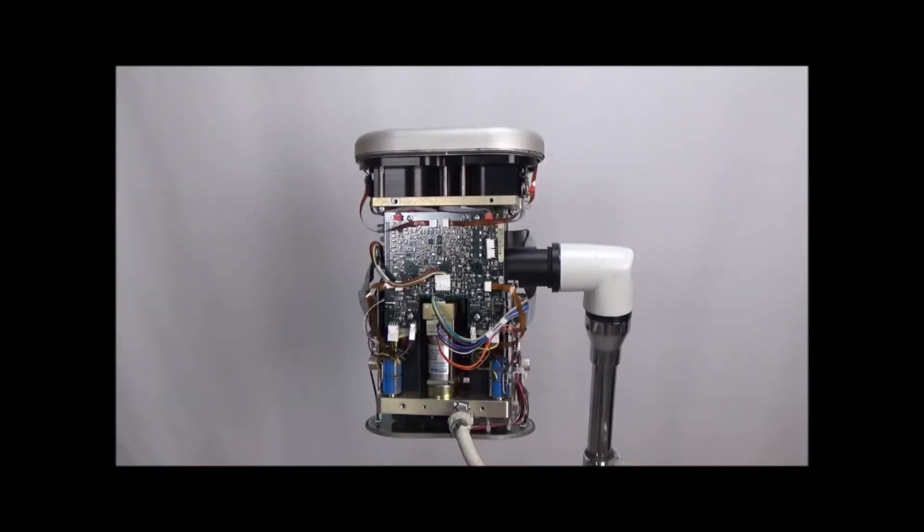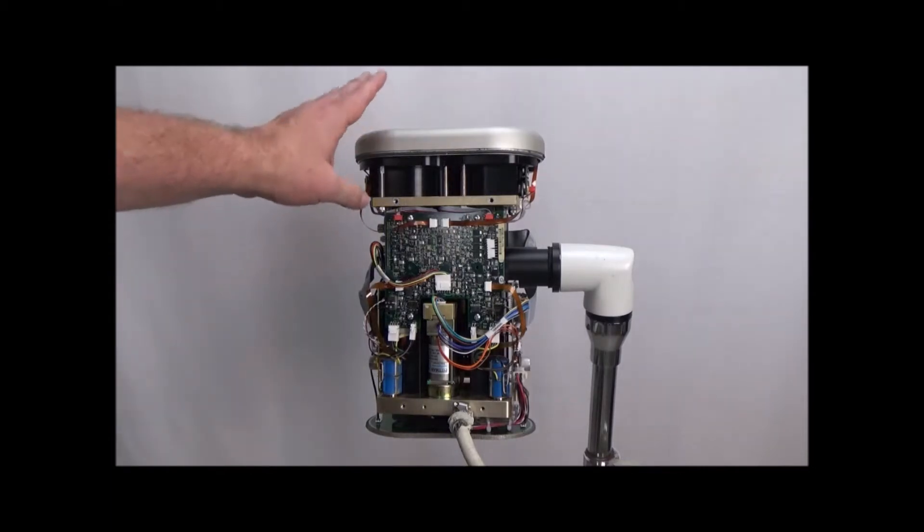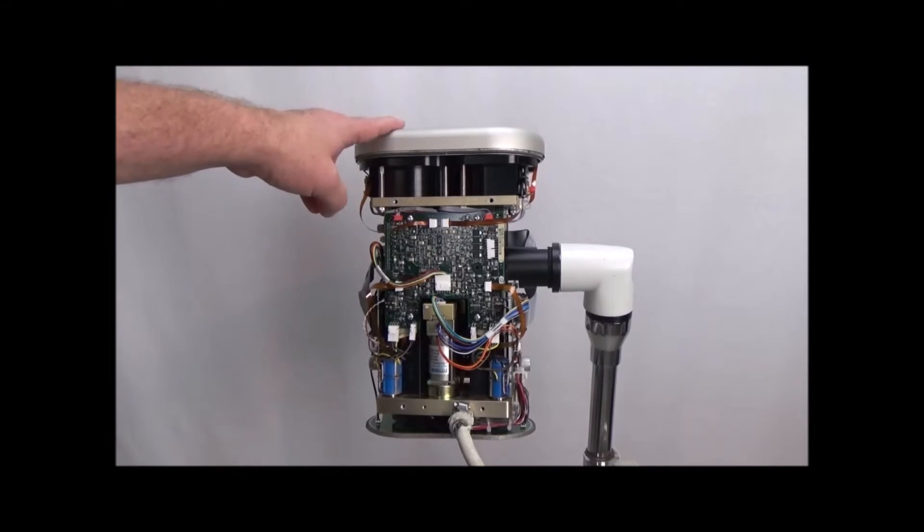Here we're going to remove the end cap of the Stellan so we can get to the flex rings. If you're watching this video, you've already been to training, so you already know how to get the covers off. So we're just going to start from this point, beginning by removing this end cap here.